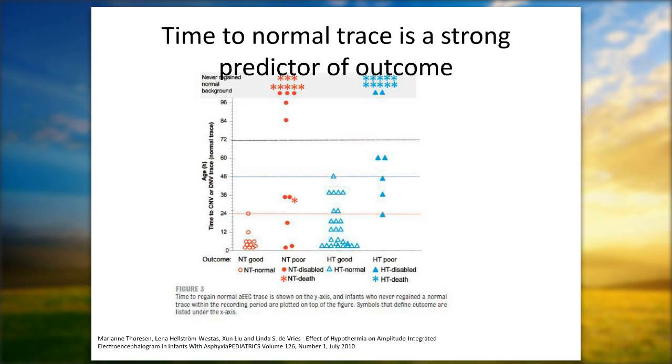So, back to your question about high discontinuous, it was probably those high discontinuous patterns versus the low discontinuous patterns. I'd have to go back and look at it exactly, but for this study, I remember there is a page where they considered normal to be both discontinuous and continuous normal voltage.